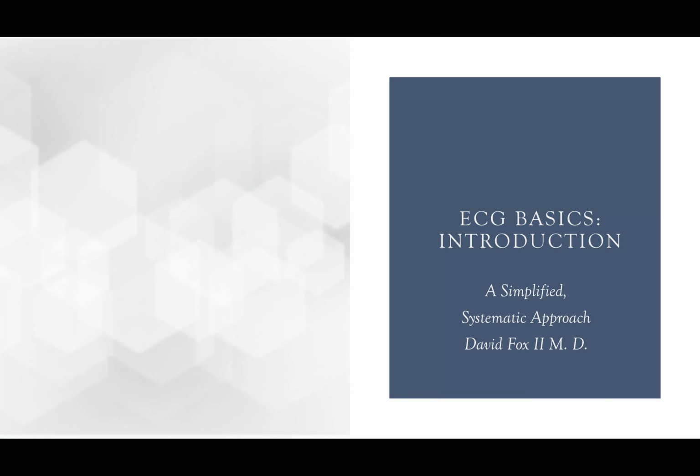So I hope that this series of lectures will be beneficial to you. What we're going to look at today is basically just the approach, something that I call a simplified systematic approach.